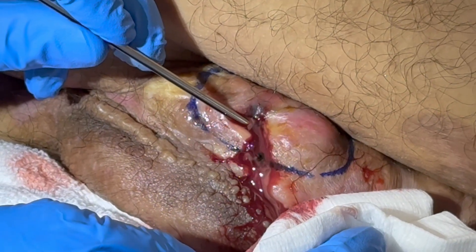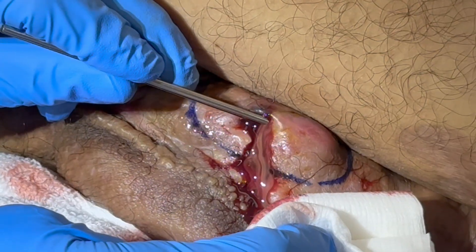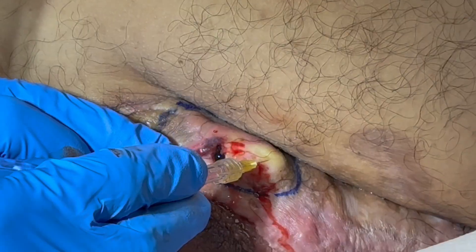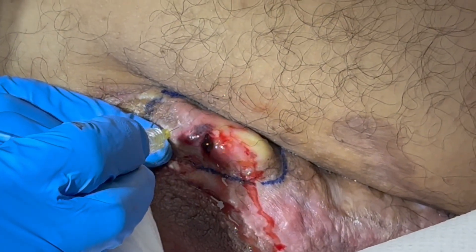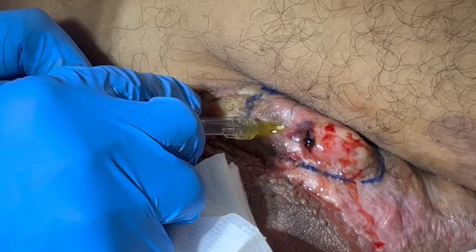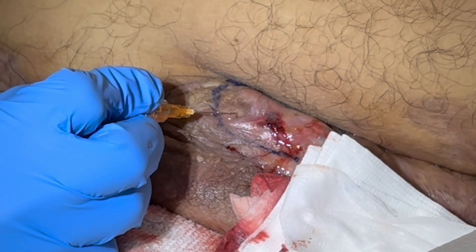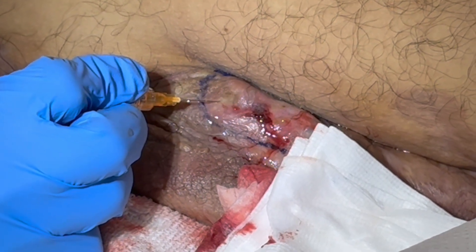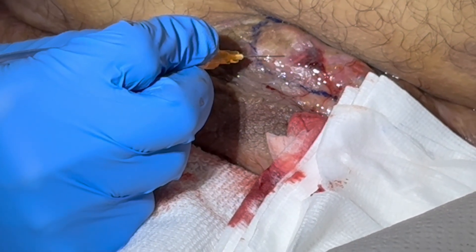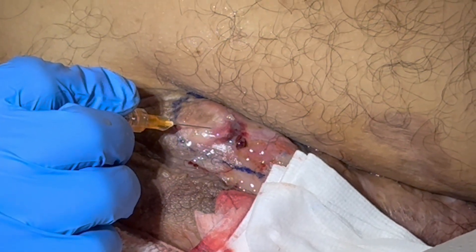Once I define the extent of the lesion, I can open the lesion, unroof it, and expose the depth to clean out all residual blood clot. During the procedure I can add more local anesthesia if there's any evidence of discomfort or bleeding. I'm using the tumescent infiltration pump to gently infiltrate the periphery as well as the deep portion of the abscess. Prior to incising the roof of the abscess, I inject additional tumescent anesthesia superficially into the dermis along the path of the blade. You can see the blanching and tumescence of the dermis — this is all painless.